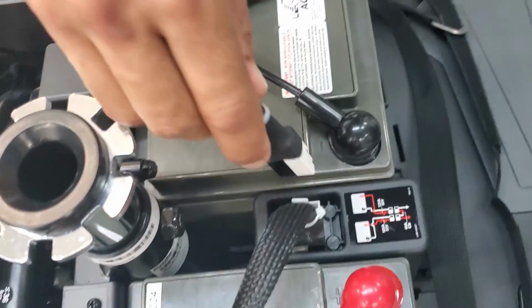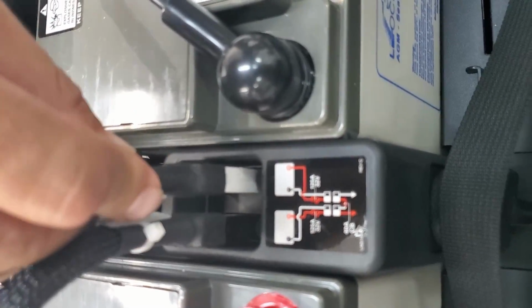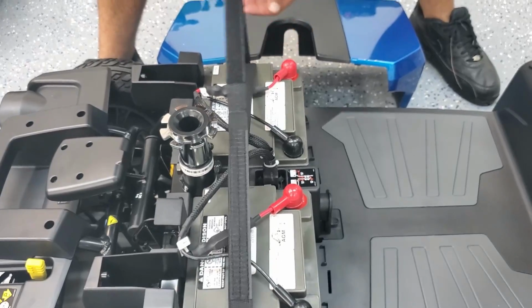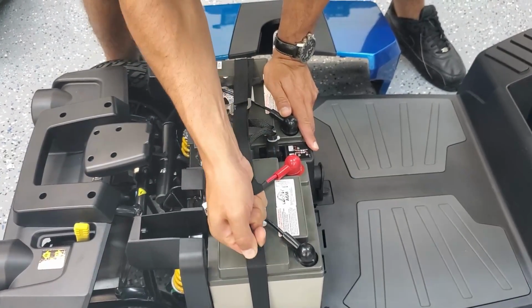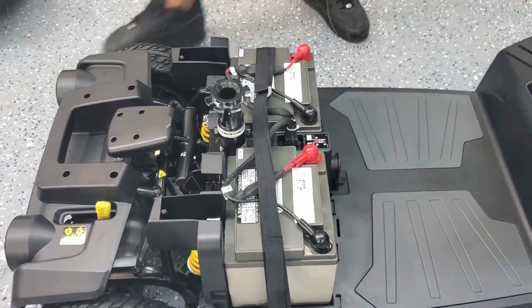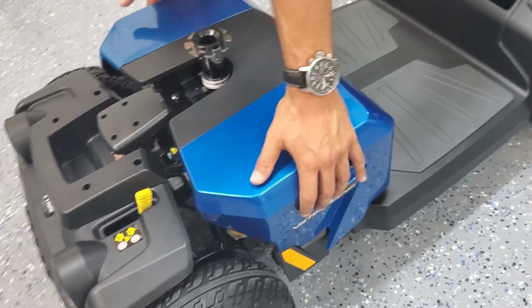Same thing on the left battery, line up the white with the black, connect it in, make sure it's all the way down. And then put the battery cover back over the connections so that you can strap everything down very tight and securely so they don't wiggle around. I always like to push the two batteries in, make sure they're towards the middle as much as possible so that the shroud cover can easily fit back on the unit.